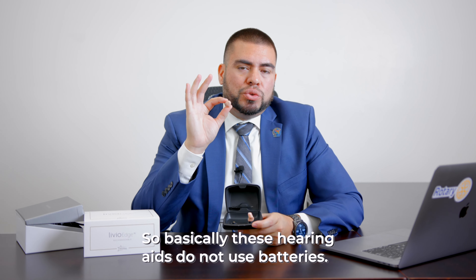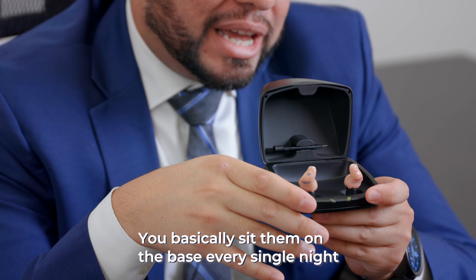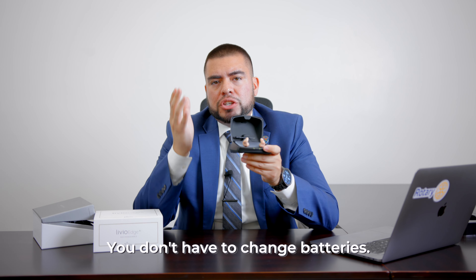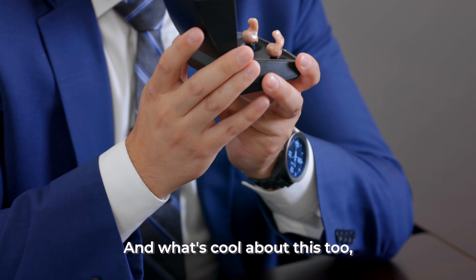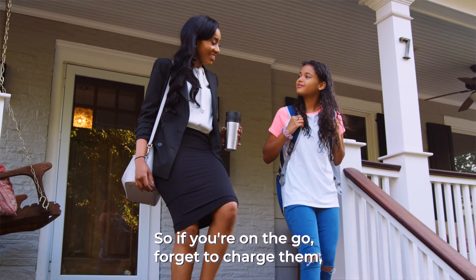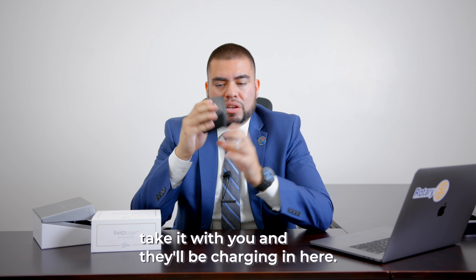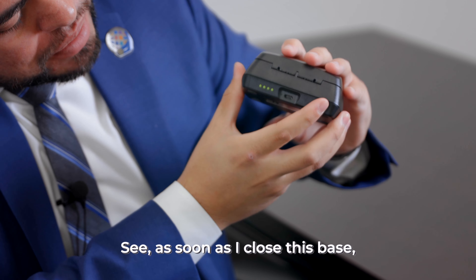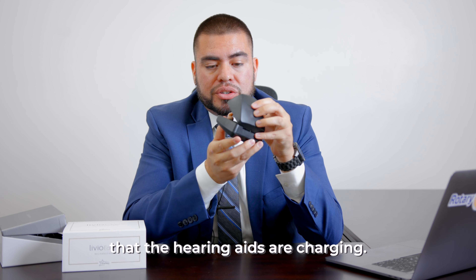These hearing aids do not use batteries. You basically sit them on the base every single night and let them charge all night — I think they get a full charge in about three hours. You don't have to change batteries, you don't have to buy batteries. And what's cool is that this case actually holds three full charges. So if you're on the go and forget to charge them, just drop them in the base, unplug the base, take it with you, and they'll be charging in here. As soon as I close this base, the little lights come on to indicate that the hearing aids are charging.